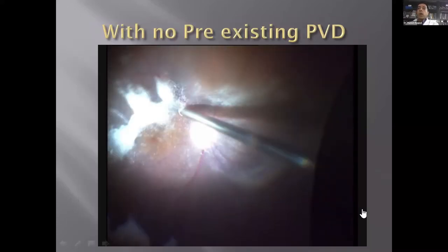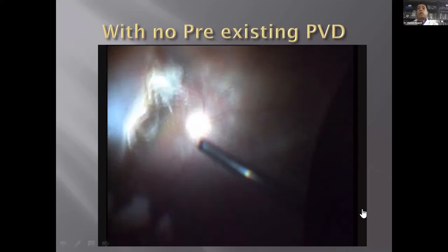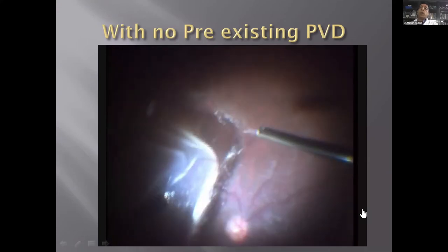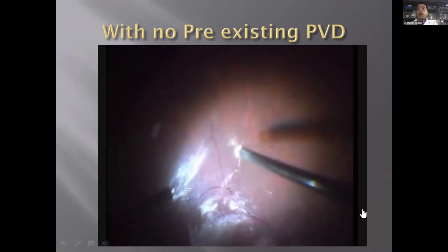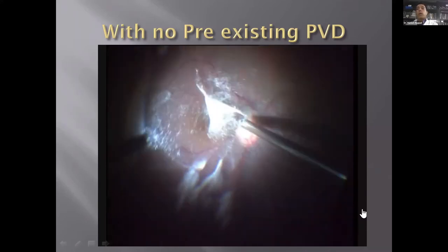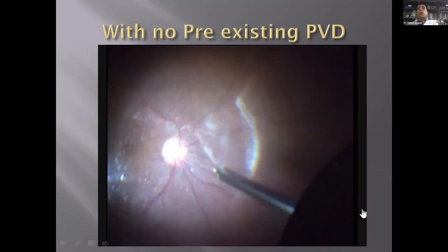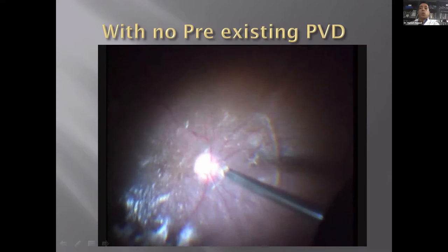Where there is no pre-existing PVD, with a detached retina, creating a PVD becomes difficult because the retina is not stable — it is moving. Every time you pull at the vitreous, the retina also moves, and you worry you may create an iatrogenic tear. We often stain with triamcinolone to help visualize the hyaloid better. Younger patients and high myopes make it more difficult to remove the vitreous, but staining helps to a large extent.